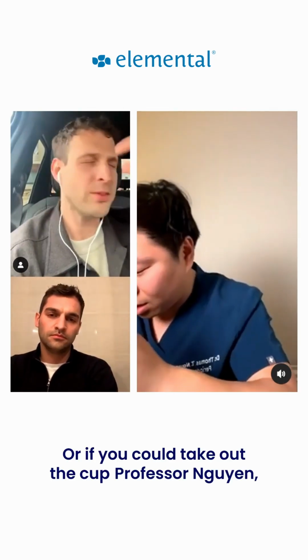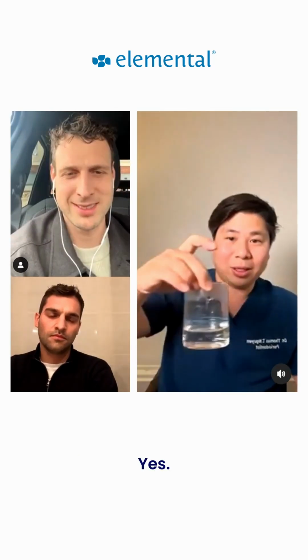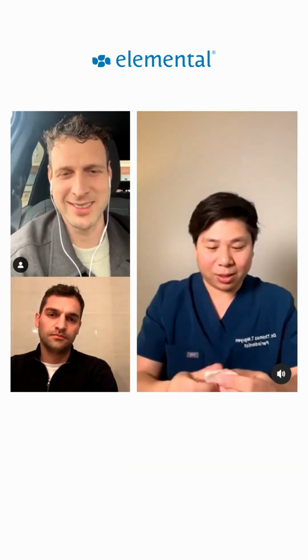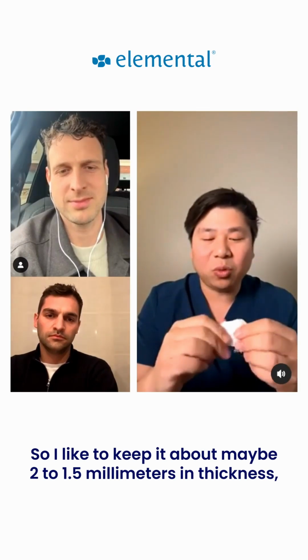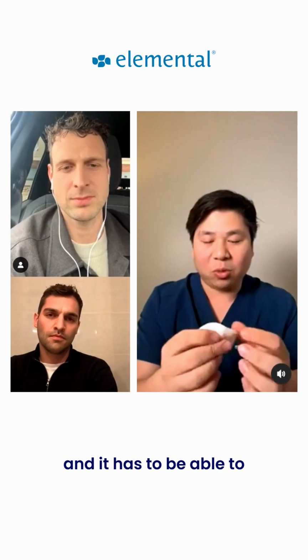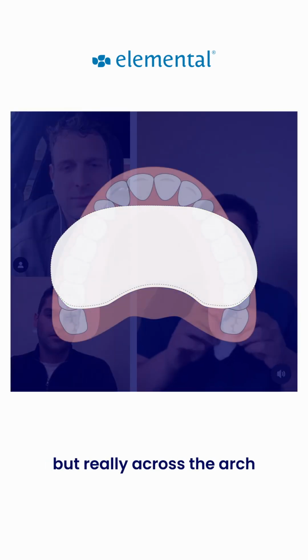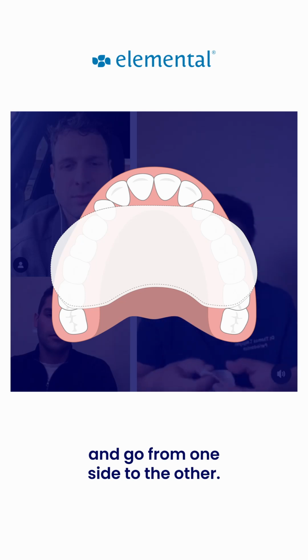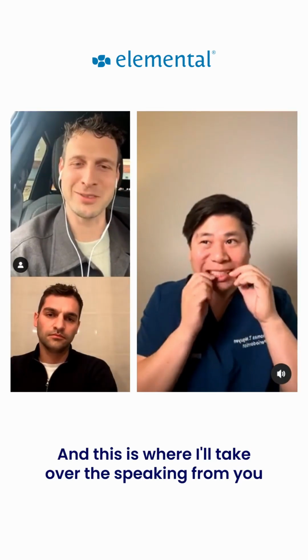Or if you could take out the cup, Professor Nguyen, then I think people also see how you're heating it. Yes, exactly. So I like to keep it about maybe 1.5 to 2 millimeters in thickness. And it has to be able to not cover my whole palate, but really go across the arch from one side to the other. There we go. And this is where I'll take over the speaking from you a bit while you shape that.